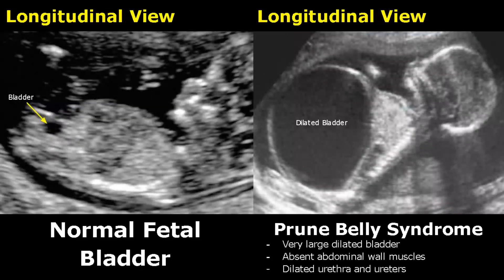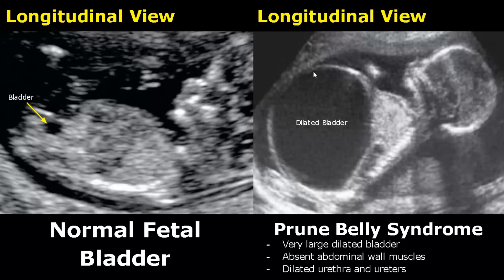In prune belly syndrome, there is a very large bladder that can even occupy the abdomen. The abdominal wall muscles are absent. Here you can see the whole bladder, this layer is also very thin, and the urethra and ureters are also dilated.